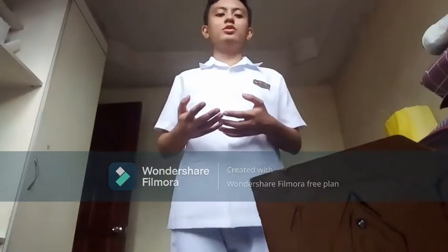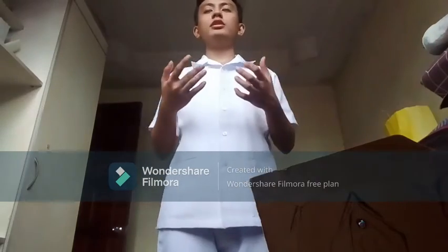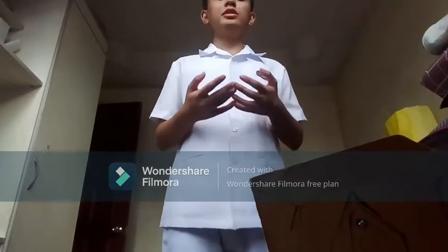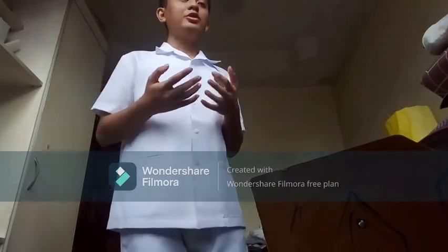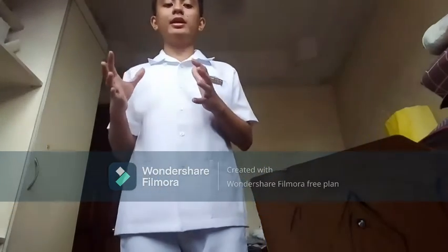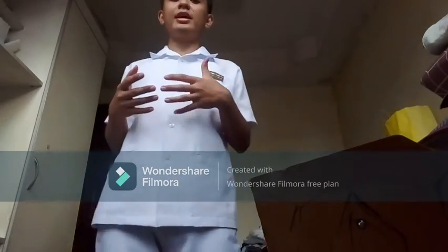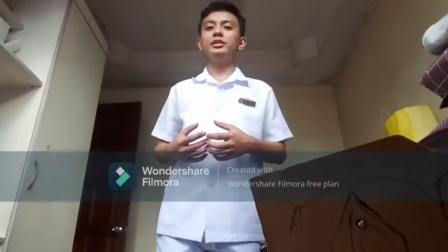tolerable. So next is to provide privacy to the patient, closing the curtains and closing the door, and by draping them, only exposing the female genitalia. Then we formally start the procedure.